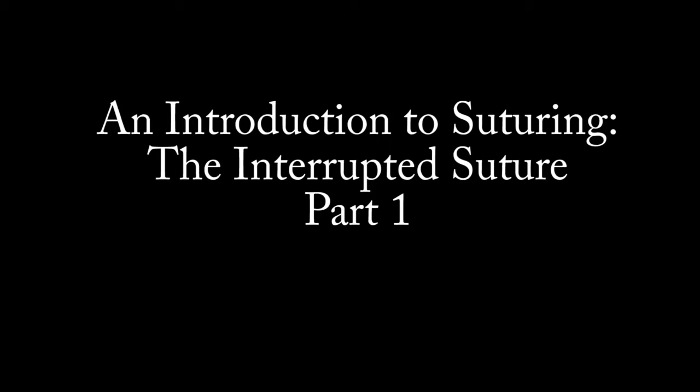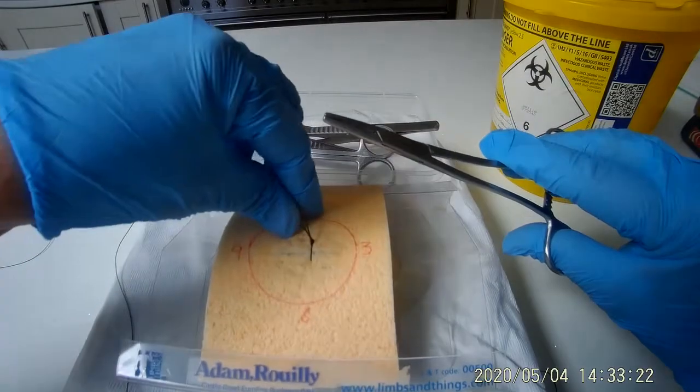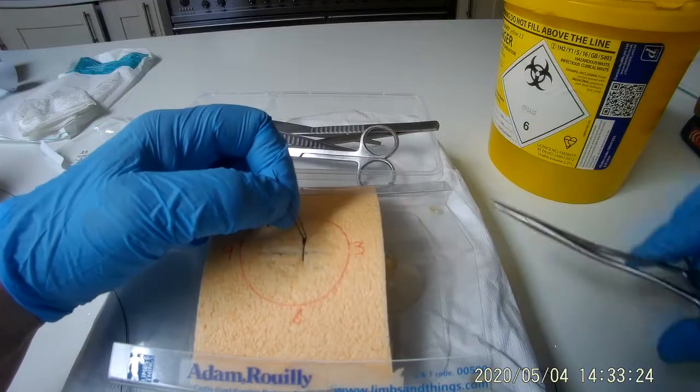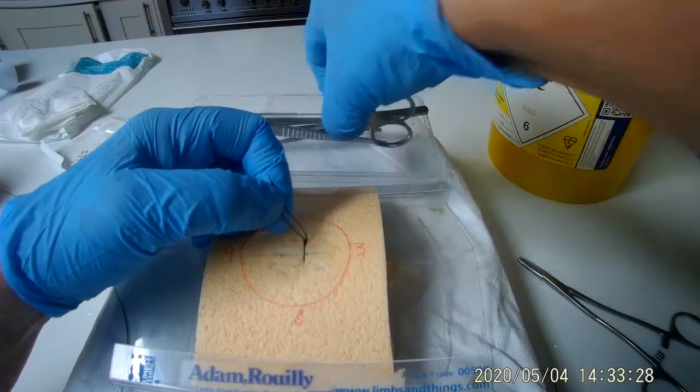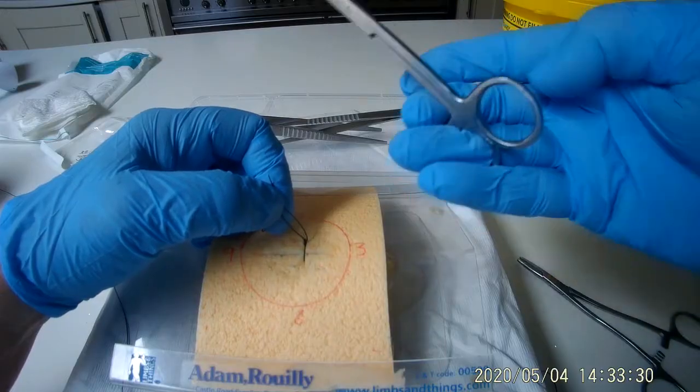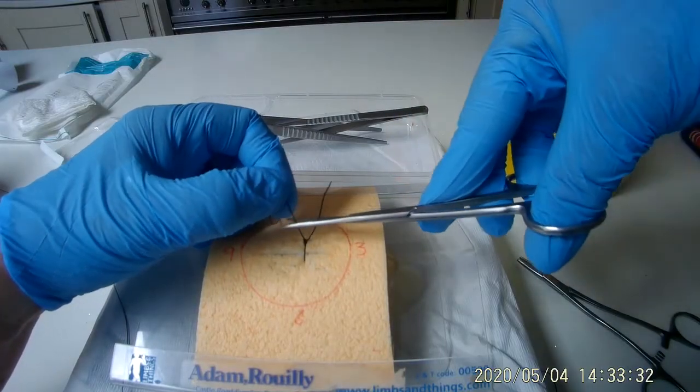Welcome to this clinical skills video demonstrating how to tie an interrupted suture. By the end of this video you will be able to handle the suture instruments correctly and tie at least one interrupted suture.